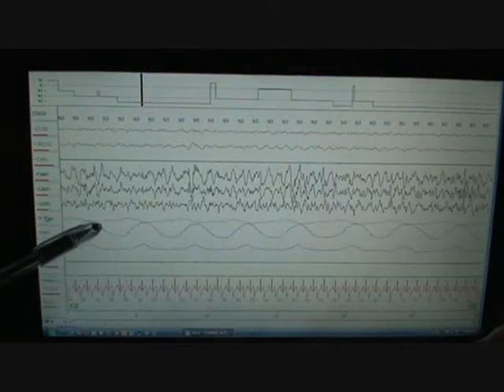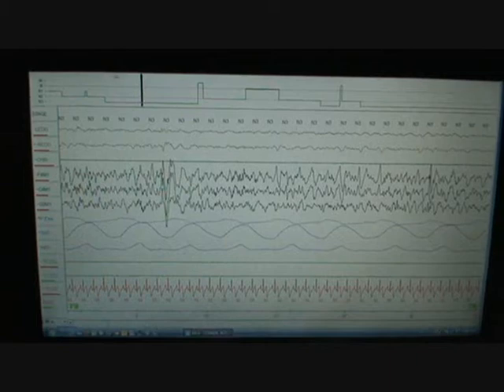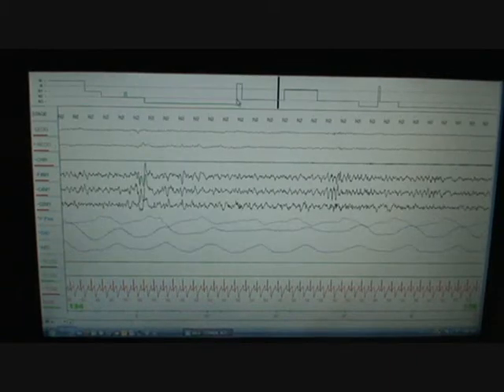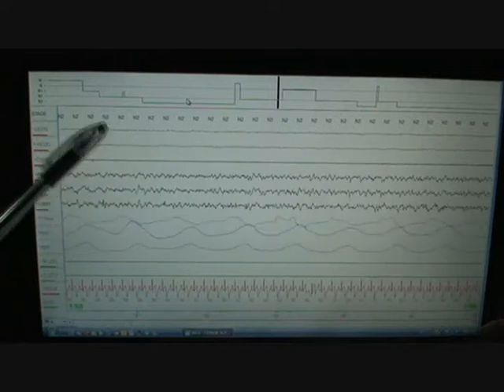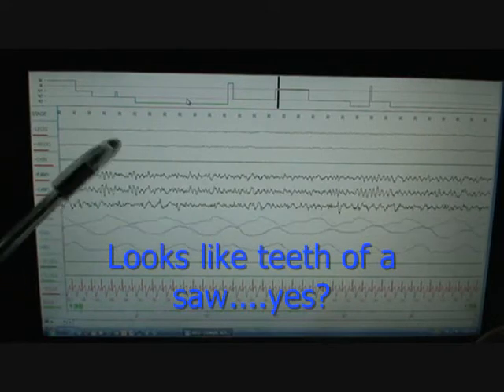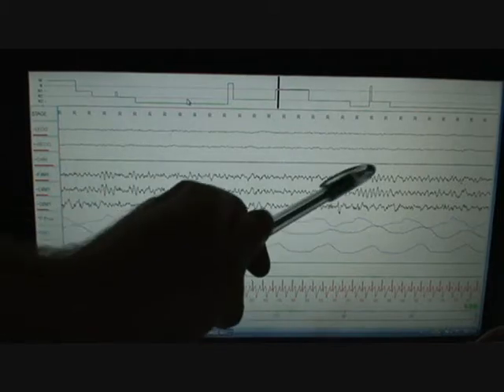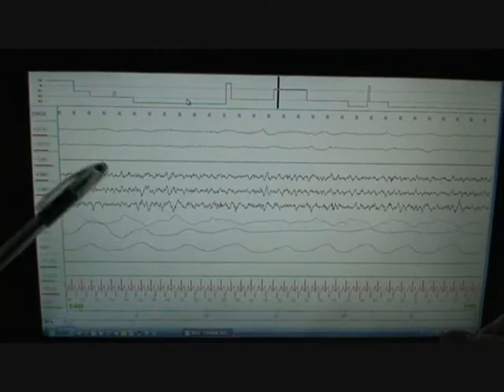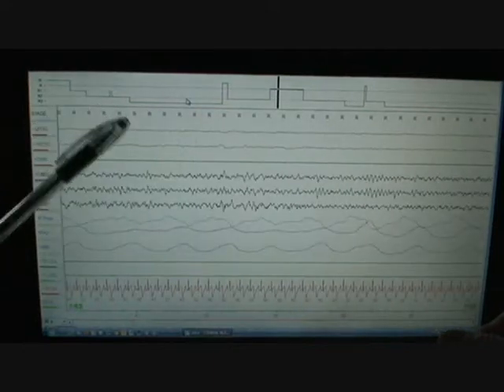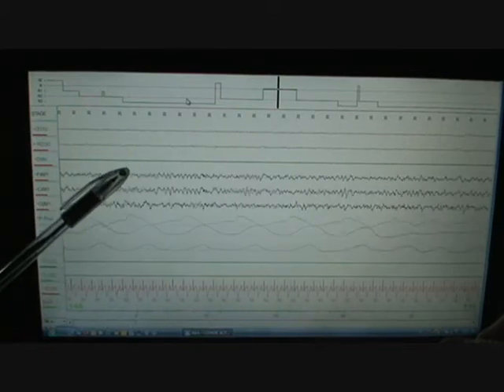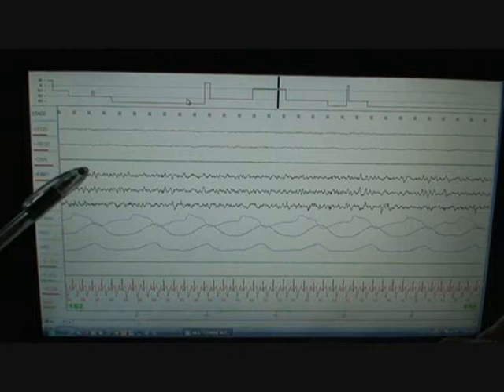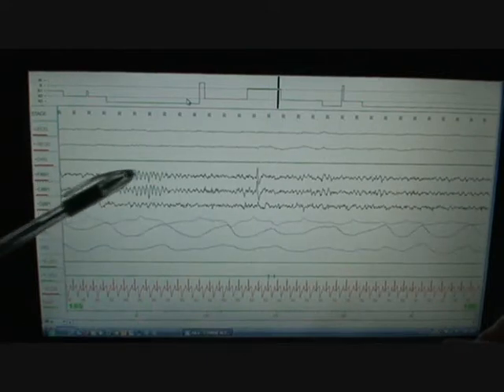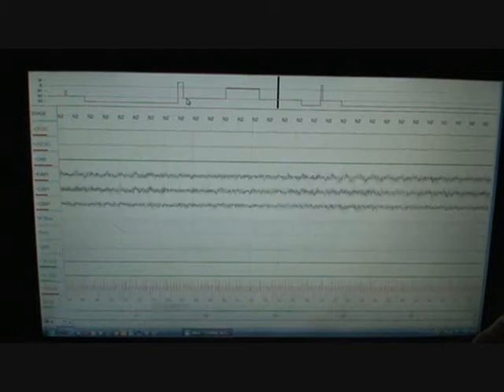So let's fast forward this and get to some REM sleep. You can see it right up here, this bar up at the top, the black bar. So what we're looking for is theta waves. They usually give it away. The chin will drop out, although it doesn't in this particular record. And we usually call them sawtooth waves because of the way they look. I don't see any here, but I actually hear some right here. Those are theta waves. They're between four and seven cycles per second. And then now you see some sharper eye movements. There's more theta waves or sawtooth waves. That's actually what people like to see most.